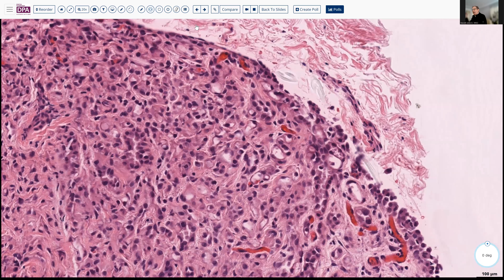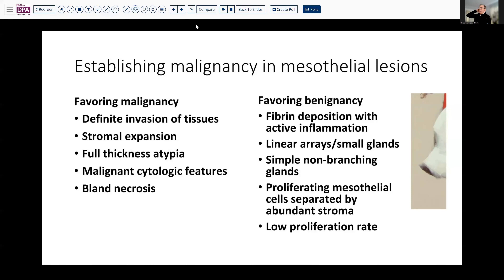Based on the appearance of this tissue, we wanted to think about — well, if this is mesothelium, is this malignant? And that can be a challenge in mesothelial cells.